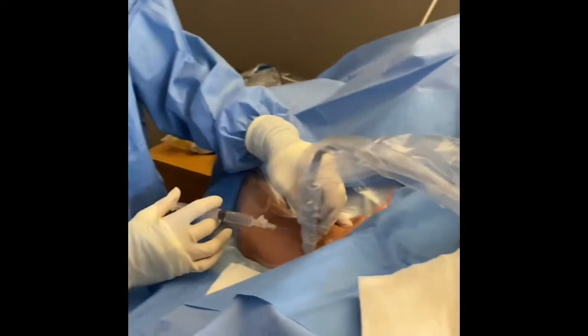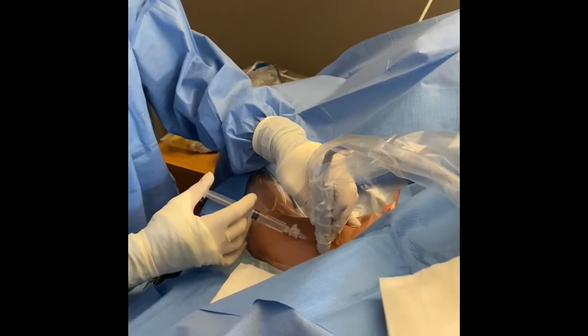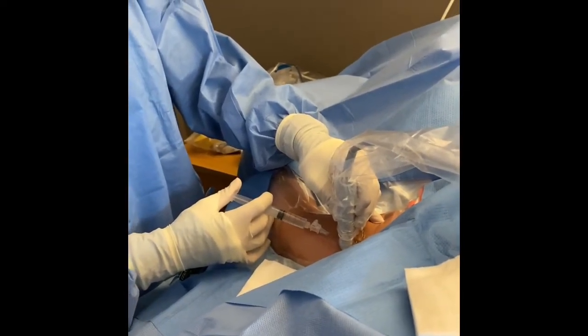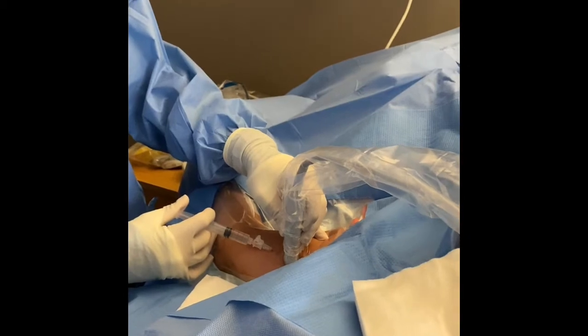You're going to feel a poke now — this is where you feel the burn. Good job. Make sure you look at the screen because you might be collapsing the vein when you administer the lidocaine.